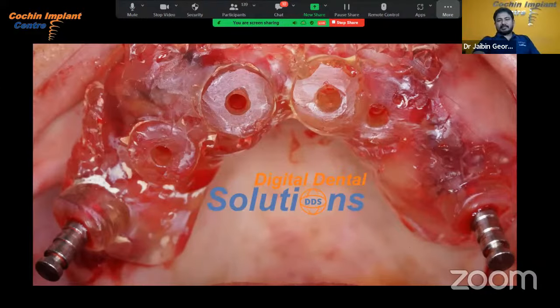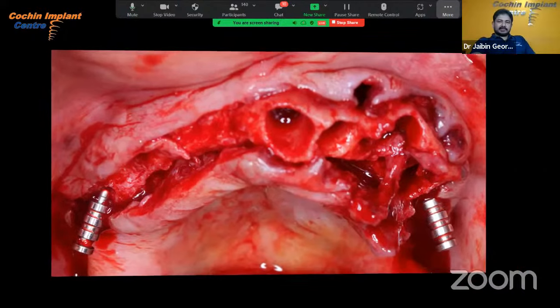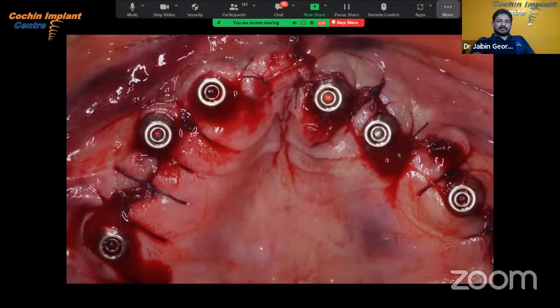In this case, I used a pilot guide. We have a center, digital dental solutions, where we make all these types of surgical guides. You can see the distal implants osteotomy is done and the parallel pin is placed into the osteotomy through the surgical guide. You can see the parallel pins, surgical photographs, and 6 implants were placed, and you can see the multi-unit healing abutments.